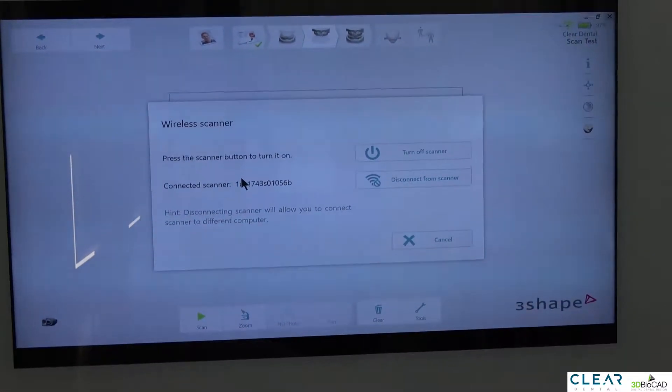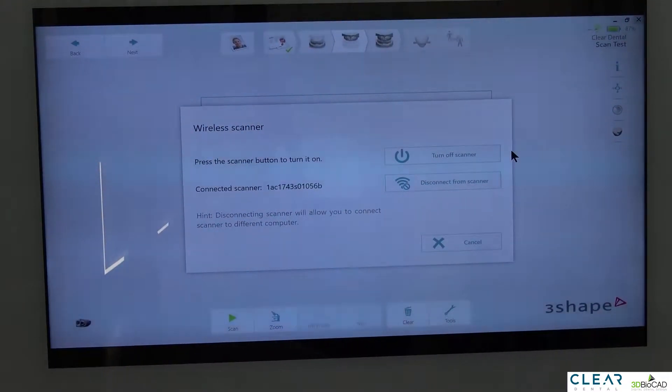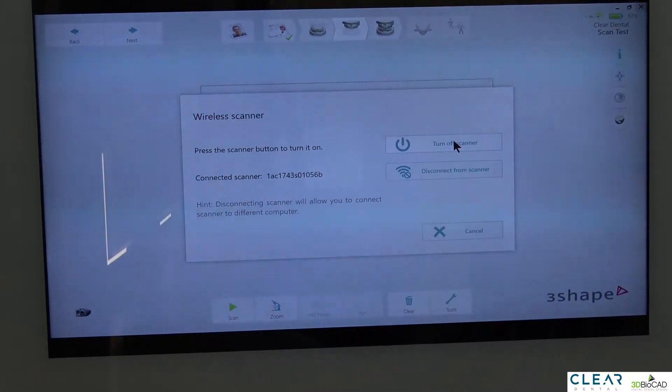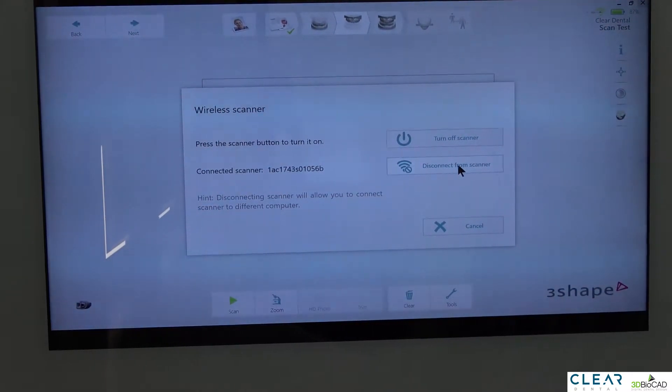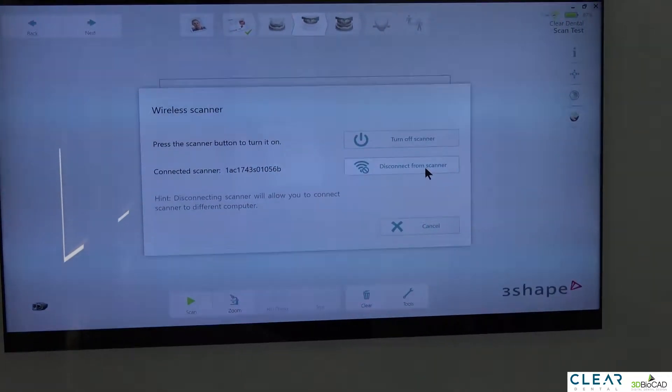If you click the TRIOS icon, this will show up. You can turn off the scanner when you're not using it to save battery life, and then turn it back on whenever you need it. There's also a button for disconnecting the scanner from the computer, which we'll talk about shortly.